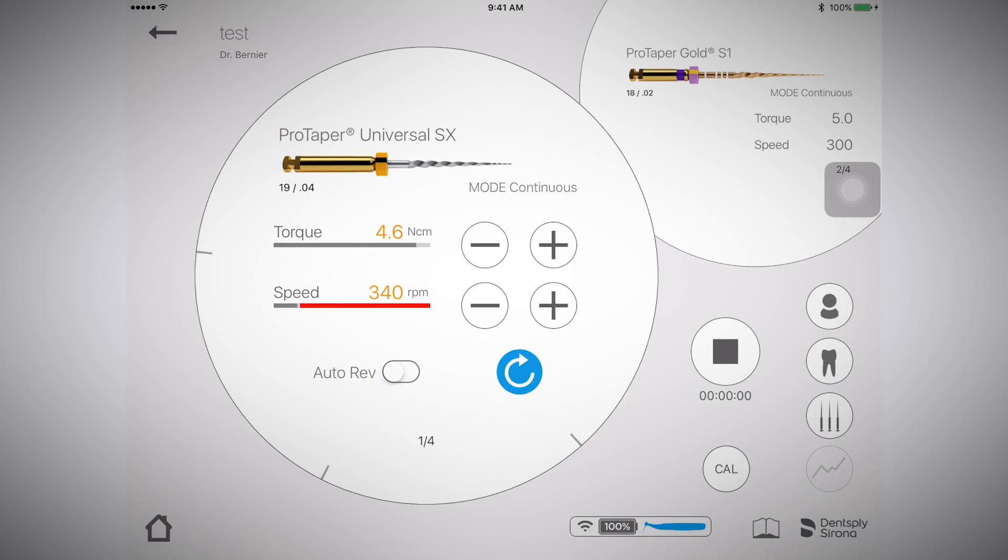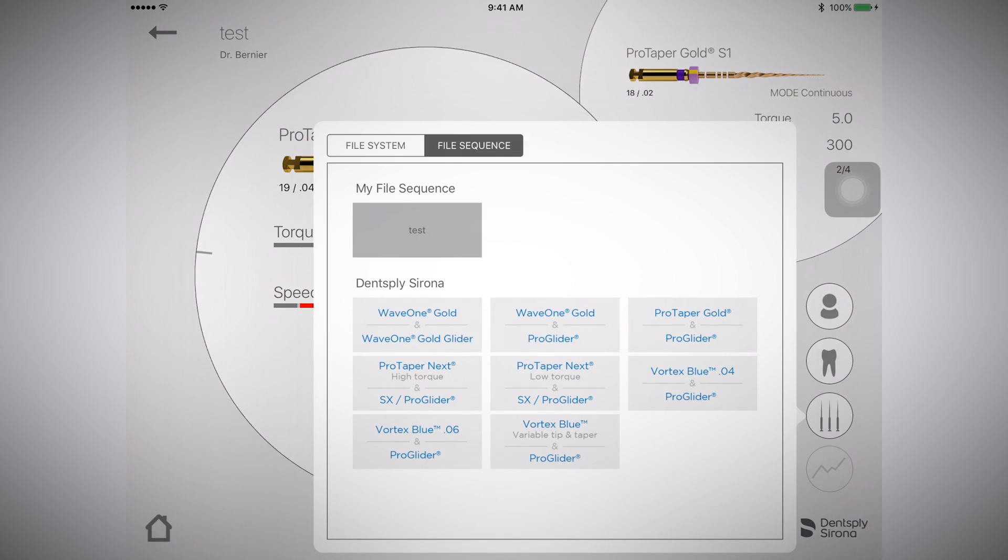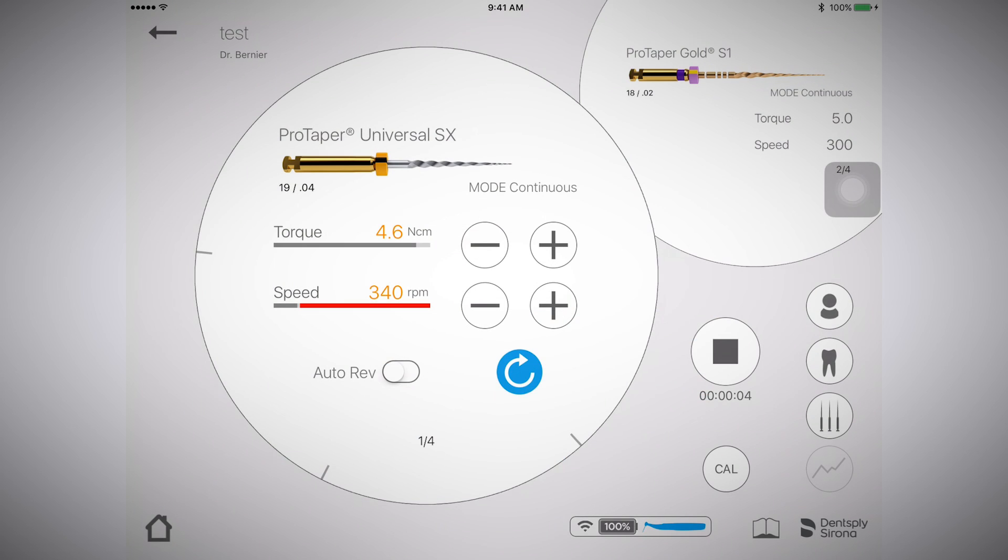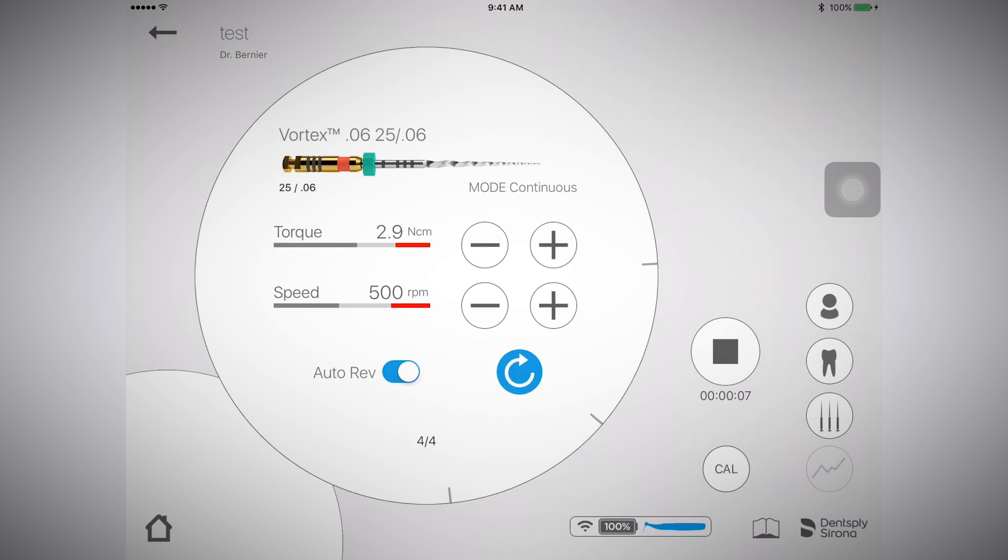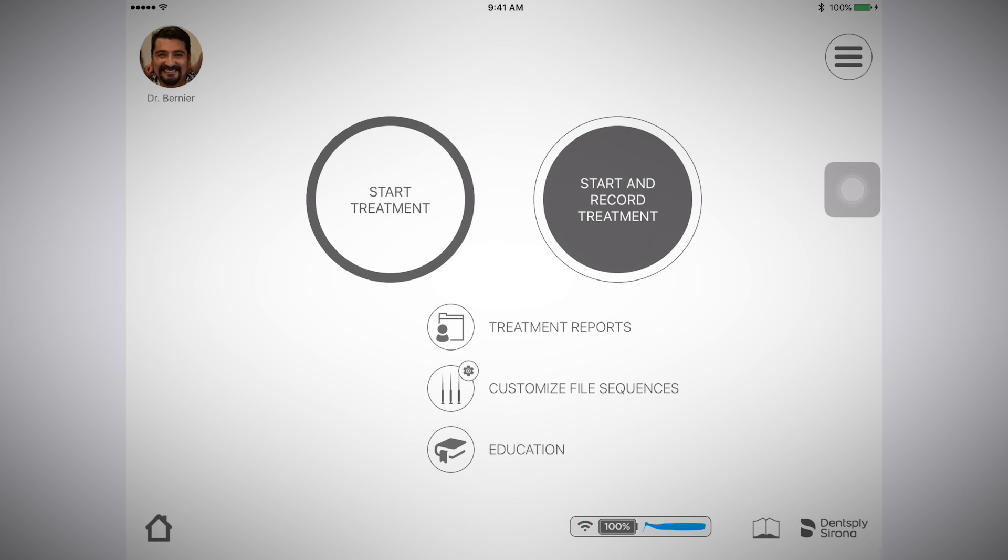On either of those pages, select the icon of the three files. Now select your custom file sequence. It will populate on the page. You can now begin the procedure using your custom file sequence.